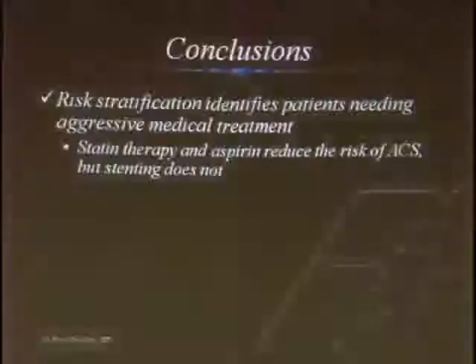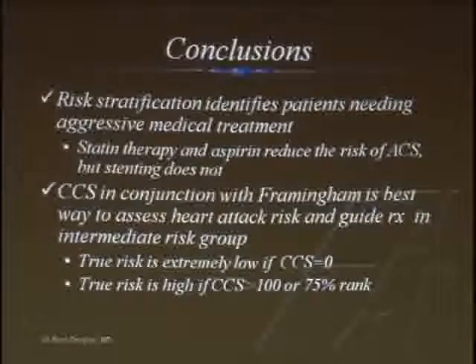Okay, so I'm going to change gears and I'm going to go more quickly. I think this was the more important part for you out here, which is risk stratification. I'm going to talk a little bit about coronary CT angiography. Probably not as important for you on a day-to-day basis, although I think there's so much misinformation about this procedure that I want you guys to be just a little bit better educated than what you're going to read from the op-ed pieces. So first we'll do conclusions here. I think I've killed that horse enough.